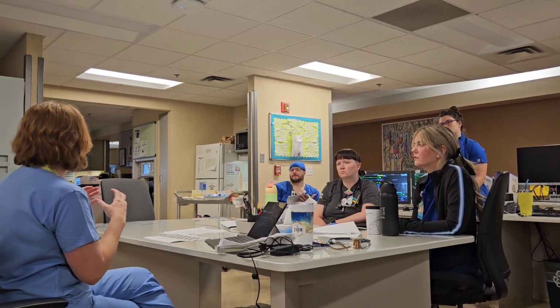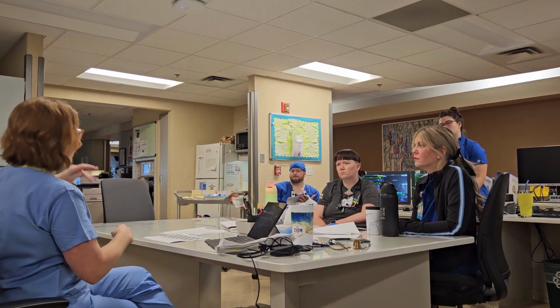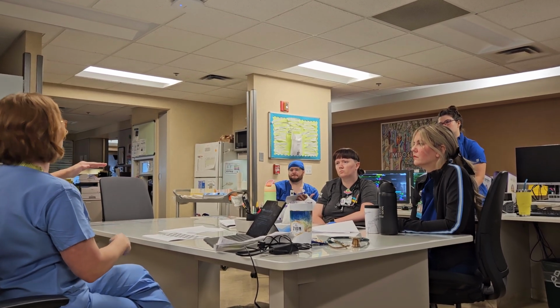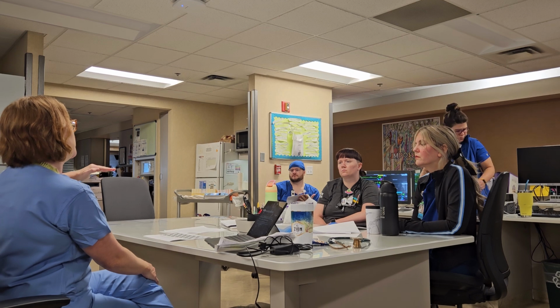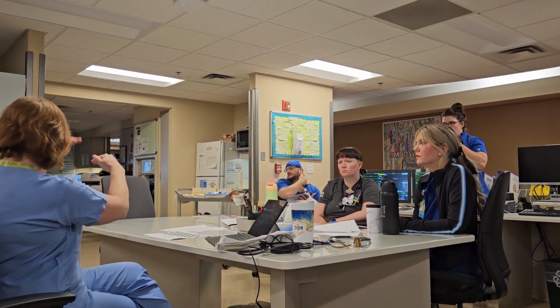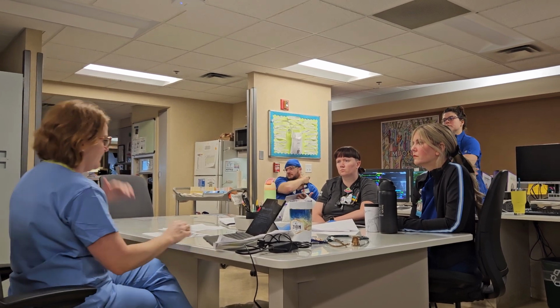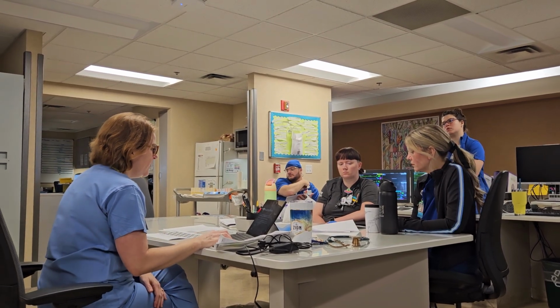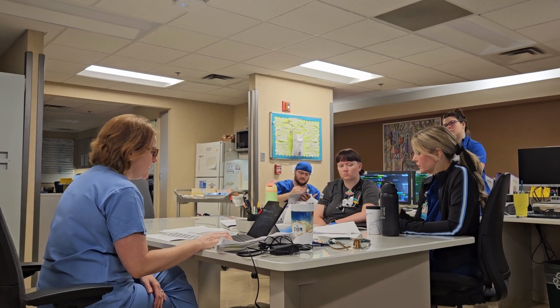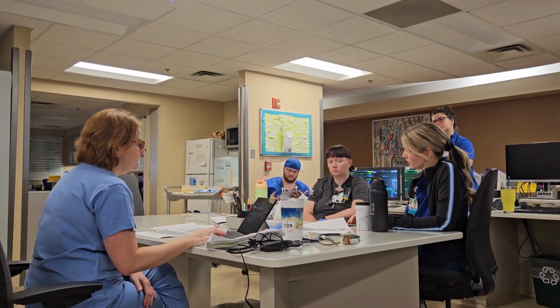So pressure control can allow for a patient to be dyssynchronous, but the ventilator will say, okay, you want to take a breath now, but we're going to make sure that we cap this airway pressure at 30, so you can keep breathing, but we're not going to stack breaths and allow your airway pressures to go up to 45 or something like that. So pressure is the constant, tidal volume is the changing variable. Boom.